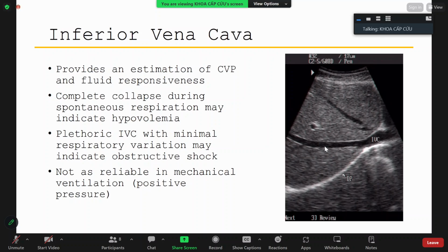one way first, just to talk about identifying the IVC, which I think can also be challenging. Sometimes you find a big vessel going down their abdomen and you may be looking at the aorta and you're not sure if you're looking at the IVC. Two ways that I use that can quickly help me identify that I'm looking at the IVC versus the aorta: one is the IVC should drain directly into the right atrium.